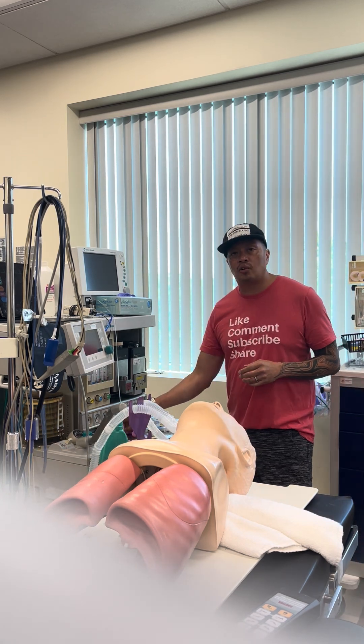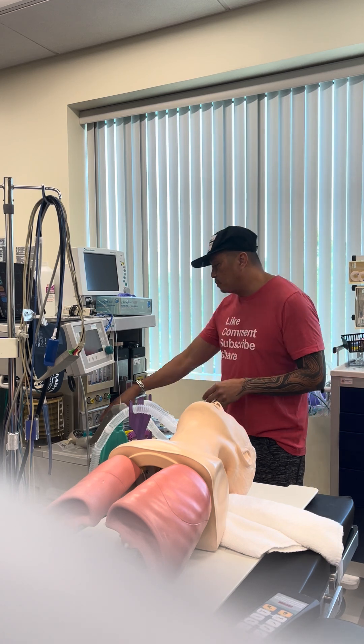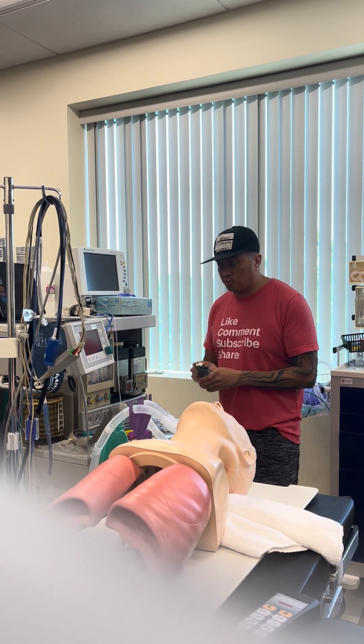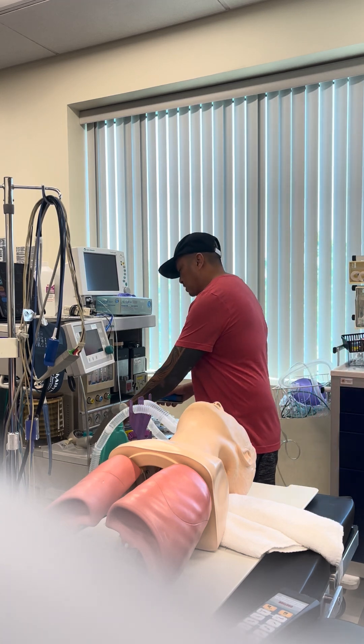So I have two different oral airways, one of different size. I also have a tongue blade. Speaking of blades, I have two different blades — one Mac and one Miller. I'm going to open it, make sure the light is working, and that it is clipped on.